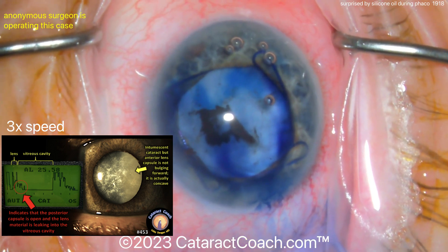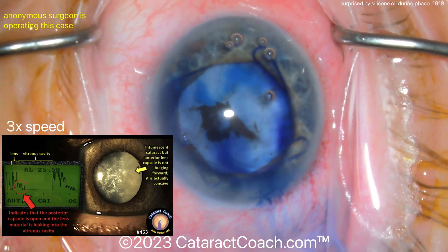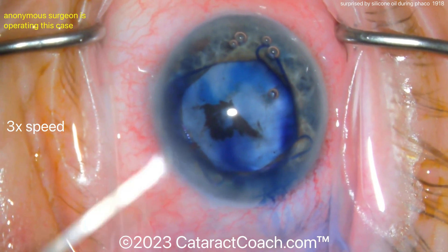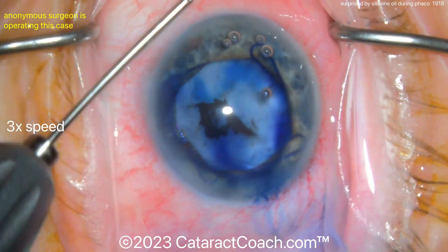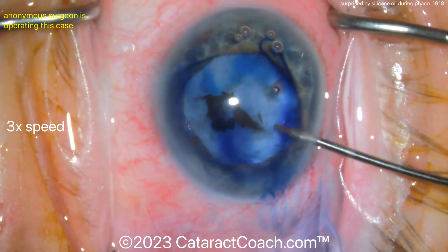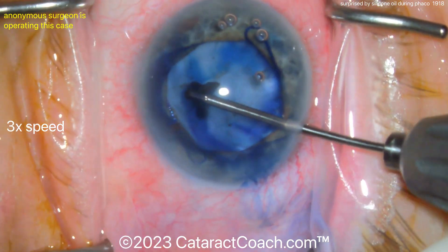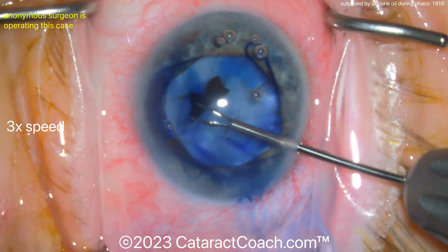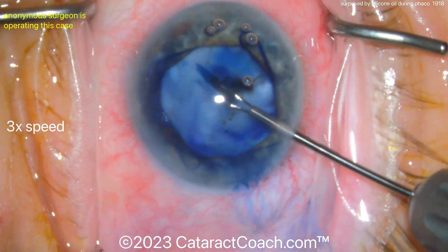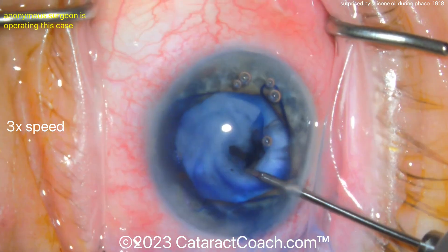This patient had damage to the posterior capsule during vitrectomy, and as a result, developed this white cataract shortly thereafter. All the lens material became hydrated. The nucleus, the majority of it, has already fallen into the vitreous cavity. Obviously you can't see it — there's no view because the cataract is completely white and opaque.